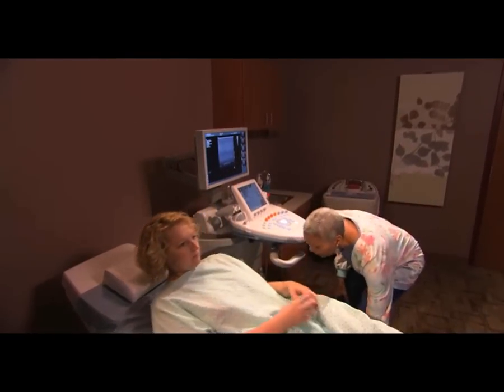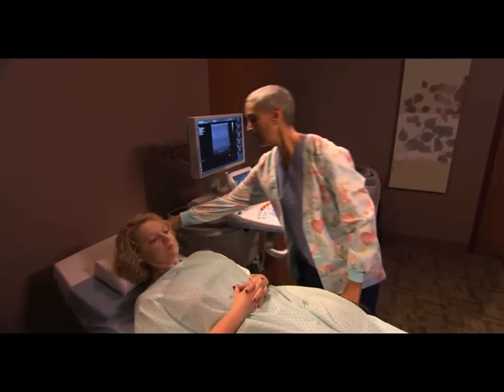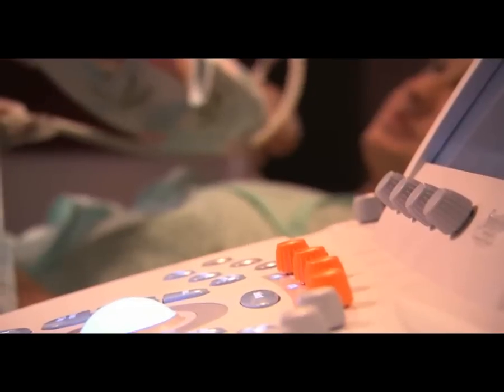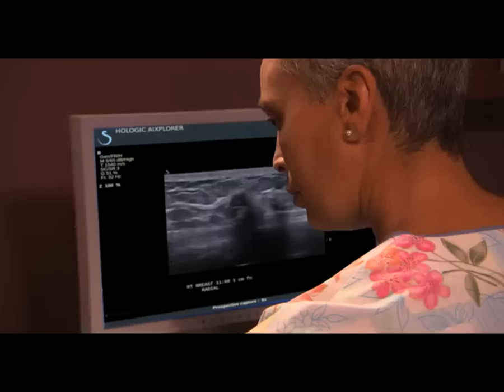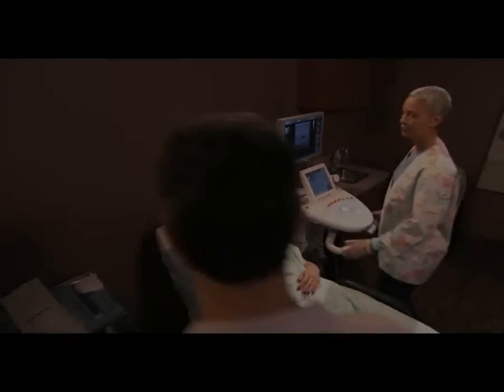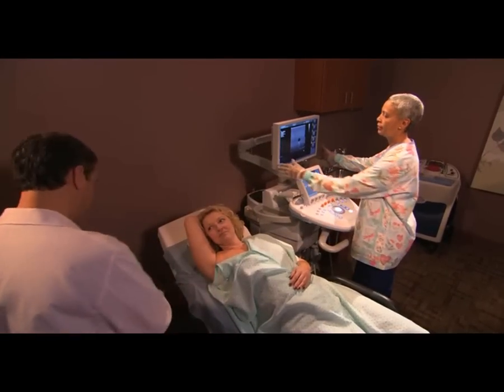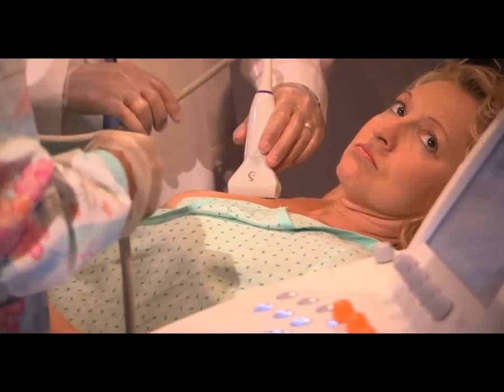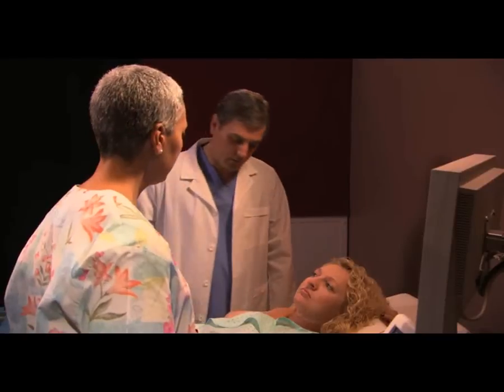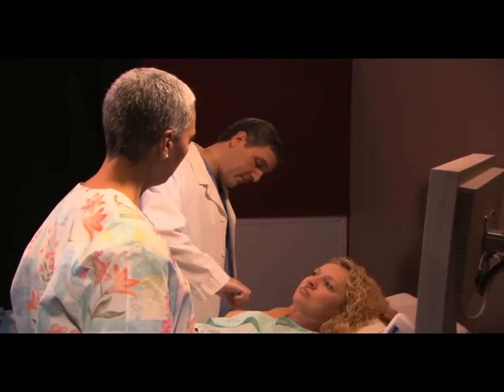First, you will lie face up on an exam table. An ultrasound probe will be used to locate the exact point in your breast where they want to take a tissue sample. At this point, your physician comes in and double checks the target position with the ultrasound device. Next, your breast will be cleaned and numbed prior to making a small incision.